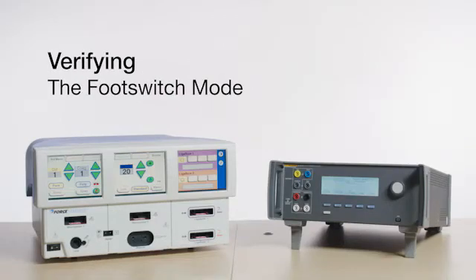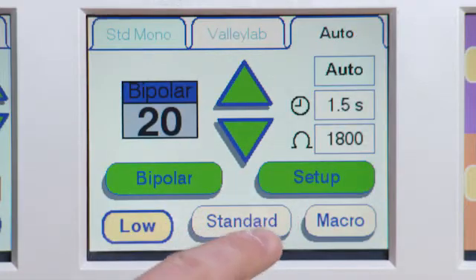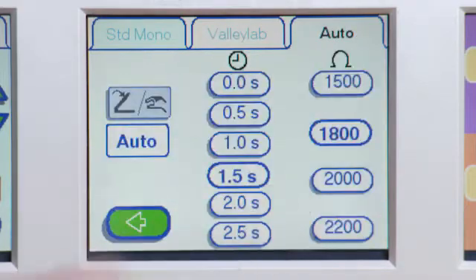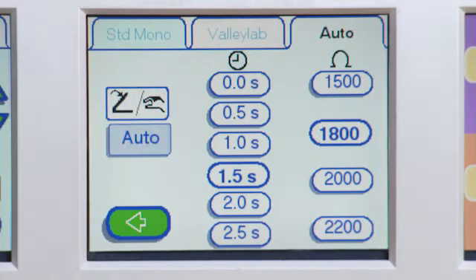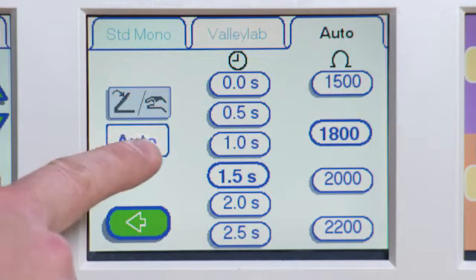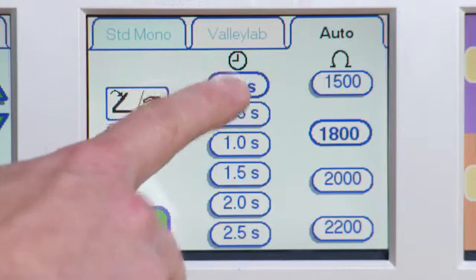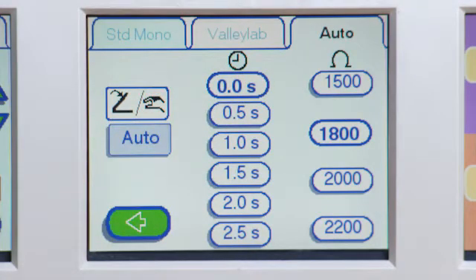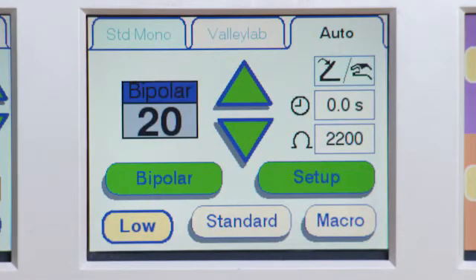Verifying the foot switch mode: Press the bipolar tab on the Force Triad, then the A and Setup buttons. Press the foot/hand graphic button, then the auto button. Ensure you can toggle between the two. Leave the unit in the foot/hand graphic setting.